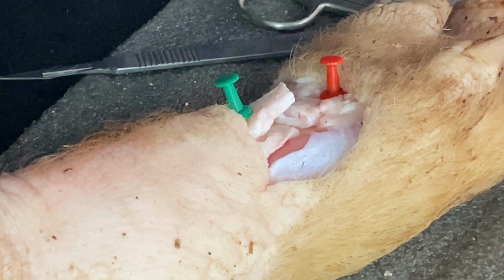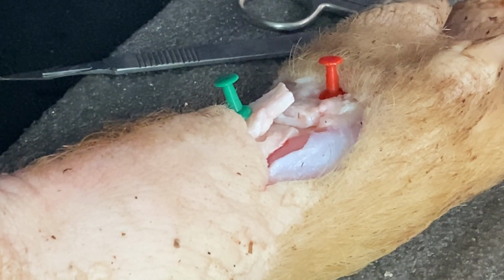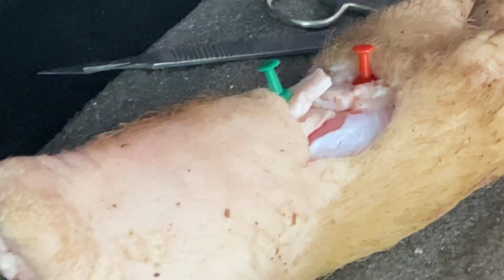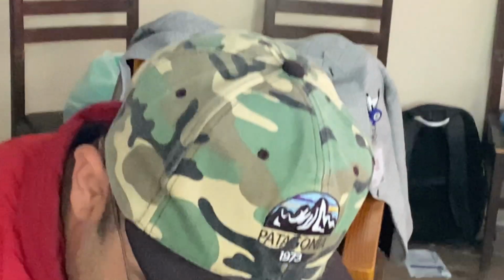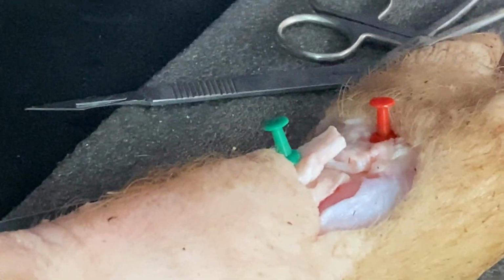So in that case, what we do is we always use a longitudinal incision, not a transverse incision like we did here. I wanted to show it directly, so I just explored the tendon and showed it to you. But in real life, we apply a longitudinal incision across the tendon and we try to identify the tendon. Sometimes the tendon will be hidden.